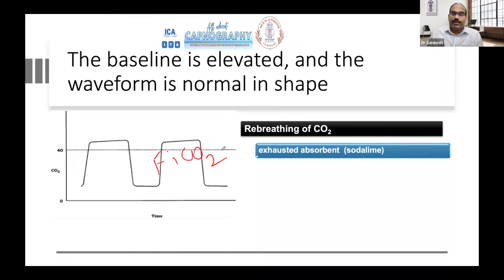But if you are going to low flow or minimal flow, definitely you have to use the maximum of rebreathed or exhaled gas mixture, and you have to eliminate carbon dioxide at the maximum. If you are increasing the fresh gas flow, probably some of the carbon dioxide will be exhausted through your APL valve, exhaust valve. That's when you get reduced rebreathing.